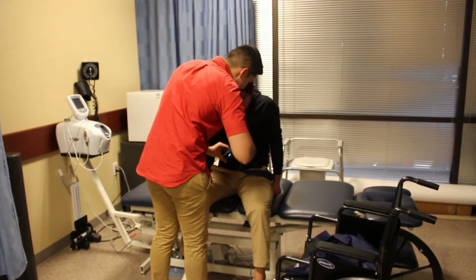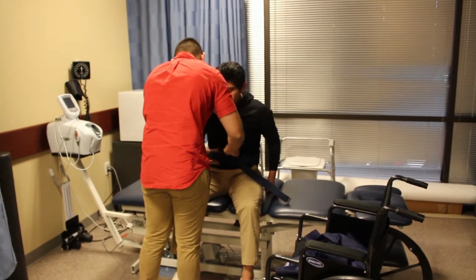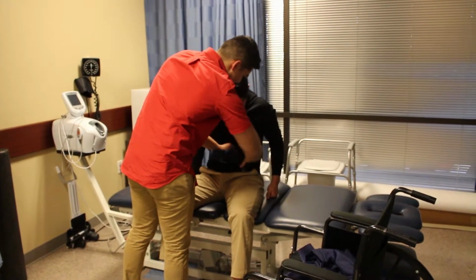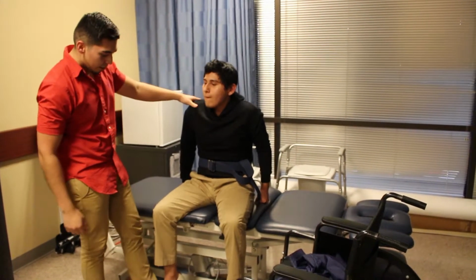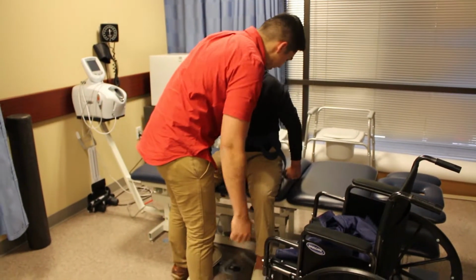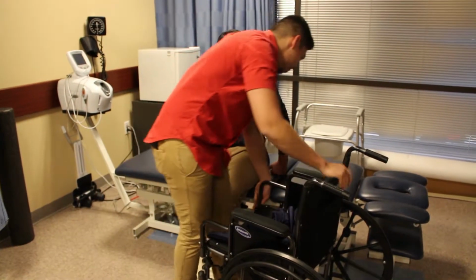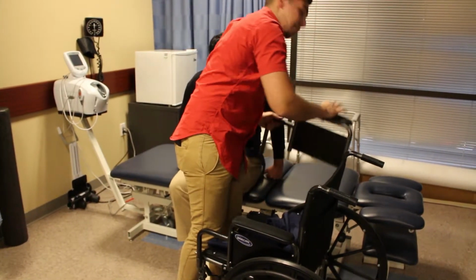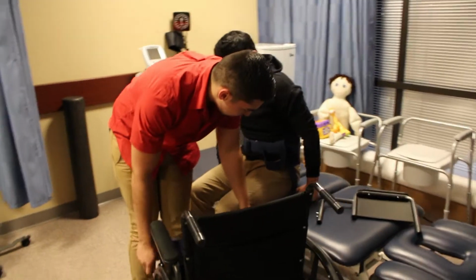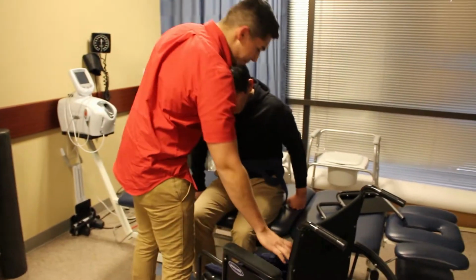You gotta make sure it's tight. That's good. You want to lower down the bed. Bring your legs together. Get your wheelchair close enough. It's easier if you take off the armrest and have the chair close enough to the bed so he doesn't have as big of a gap here where he can potentially fall.